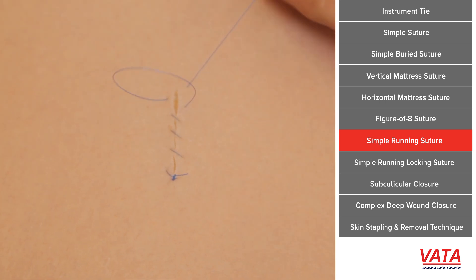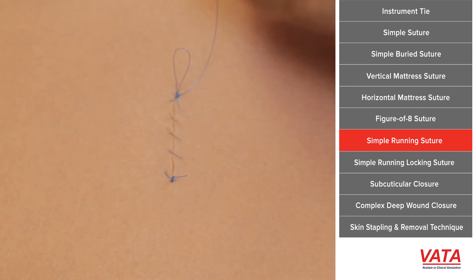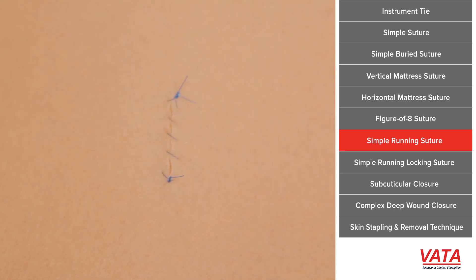If you want to get really fancy, when you're passing your needle deep to the skin, if you pass it on a diagonal, your stitches will look like they're straight across. So there are different ways to do it depending on how you want it to look. This is a suture that we do use all the time because it's fast and efficient.